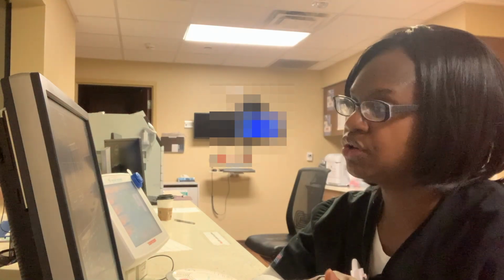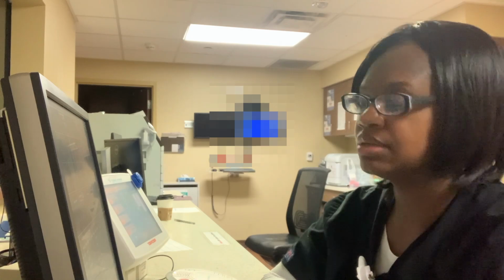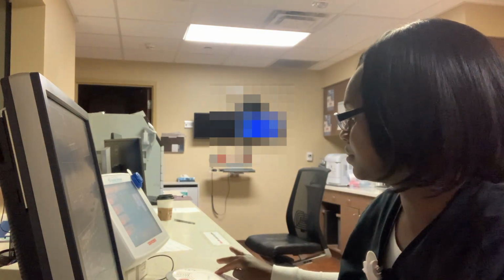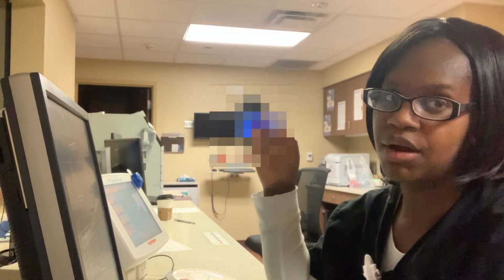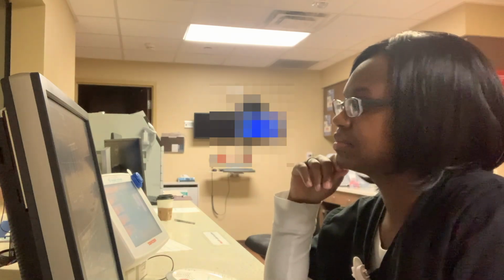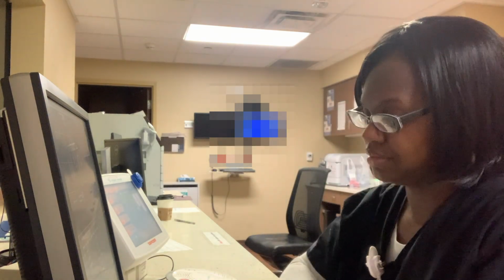So the machine is going to tell the patient to hold their breath a lot. I just got done setting it up. So you'll probably hear the machine in a second say, hold your breath. And hold it.